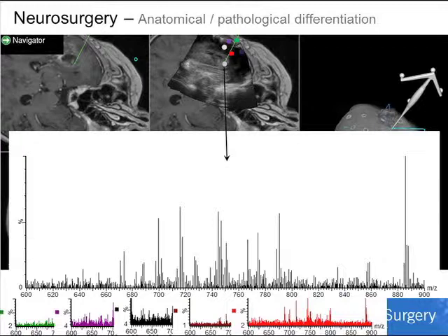What you've been able to see there as the animation has run through, as you go through each different anatomical layer of the linings of the brain and into the brain tissue, you get different spectra. So you can help augment, not replace, but augment imaging technologies that guide the surgeon in real time during surgery. And you also get data on the tumour type itself.